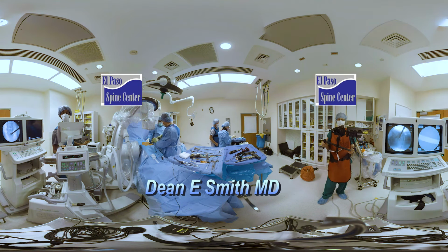Yeah, it's weird. This thing won't close unless you have it up inside the disc space. So I always pick it up and say, hey, it's not working. Yeah, it just won't work unless you have it in there.